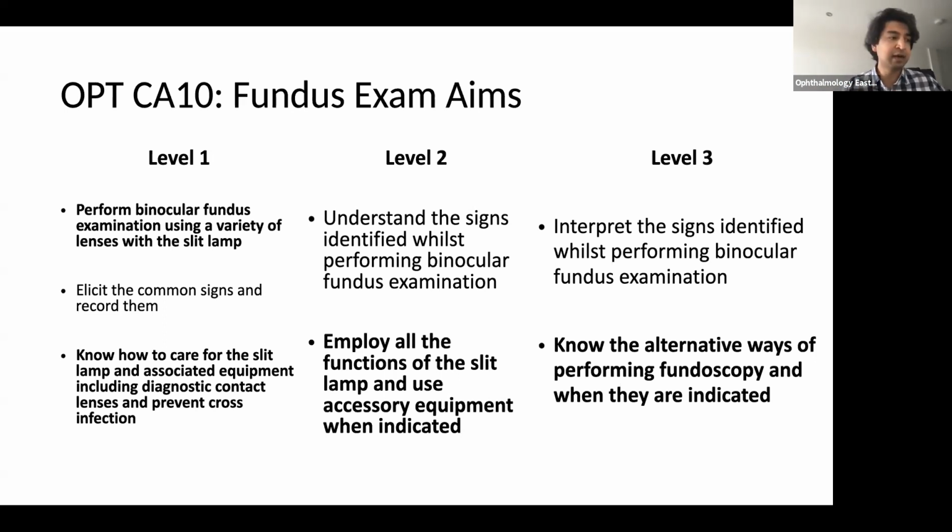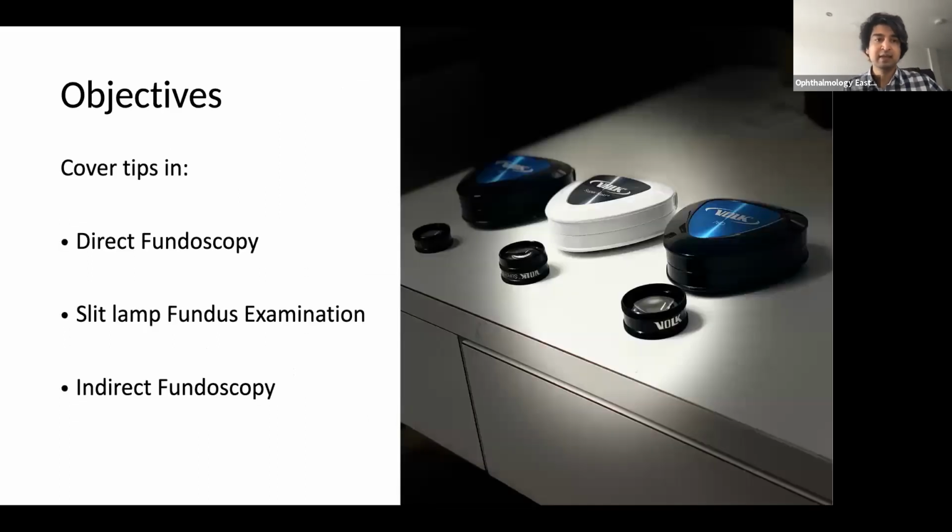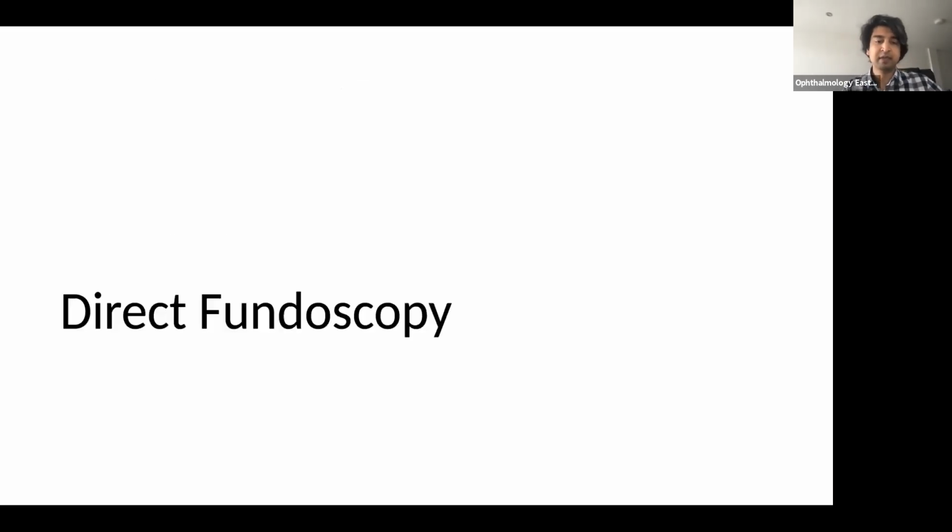I'm not going to talk about the real pathology; you'll need to look at textbooks and clinical experience. This is just about how you improve your view and see what you need to see. So I'll talk a bit about direct fundoscopy, slit lamp examination, and indirect fundoscopy.